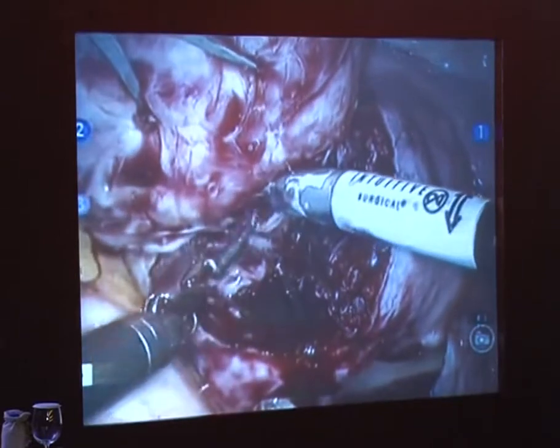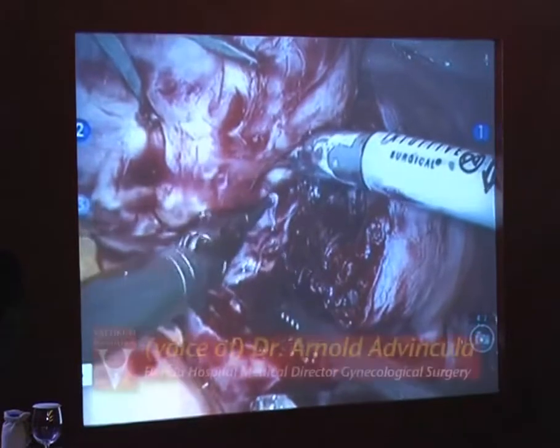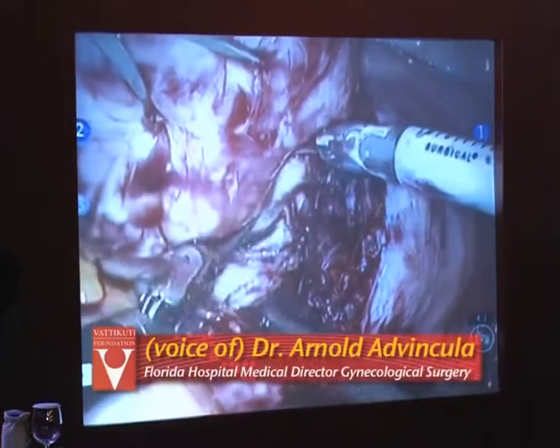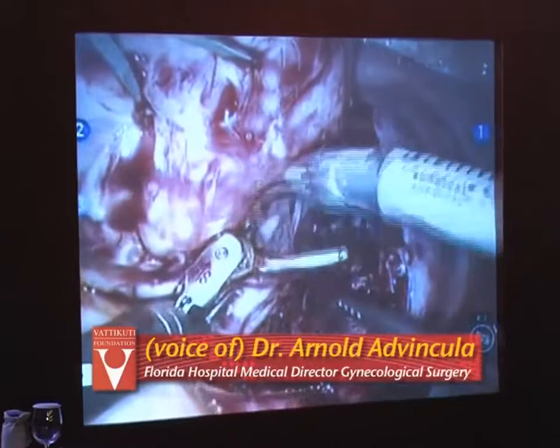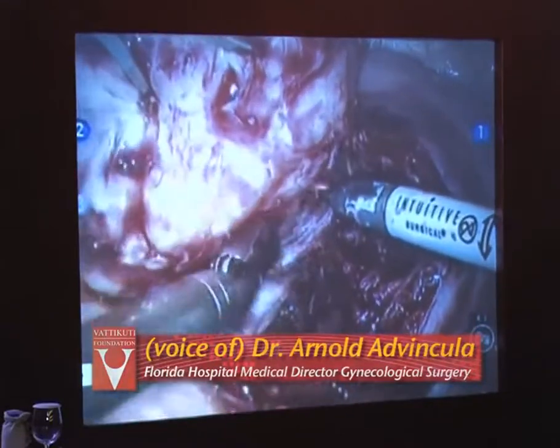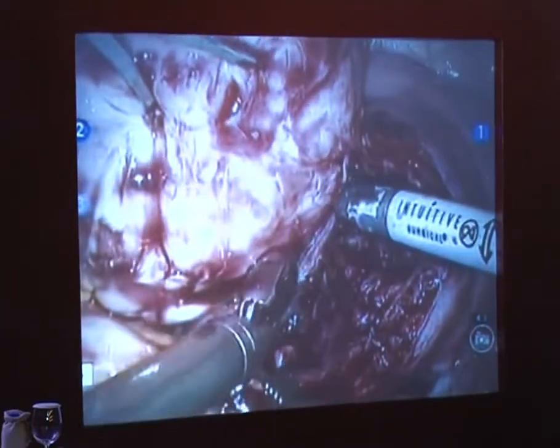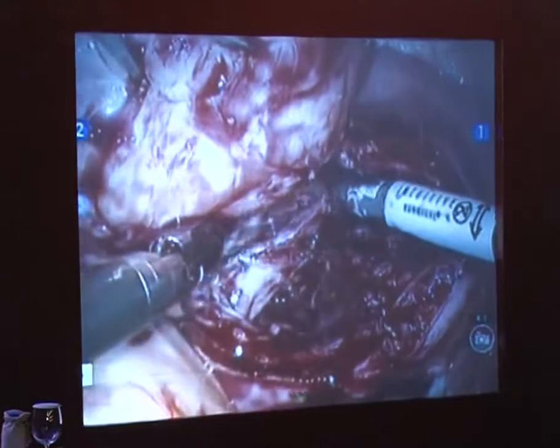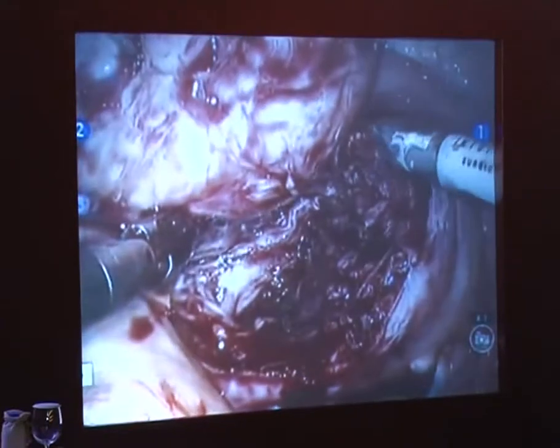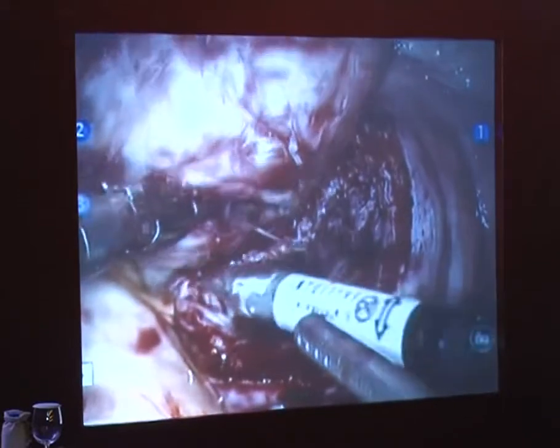Arnie, it looks like you could still do a horizontal closure, perhaps, with that defect. Possible. Can you lift the uterus up a little bit? That's good, right there. That's good, just like that. Actually, I think I'll be able to close this with it somewhat vertical. Should close pretty good this way. Now, I didn't take a lot of extra out here, because this is the way the uterus is unfortunately shaped.